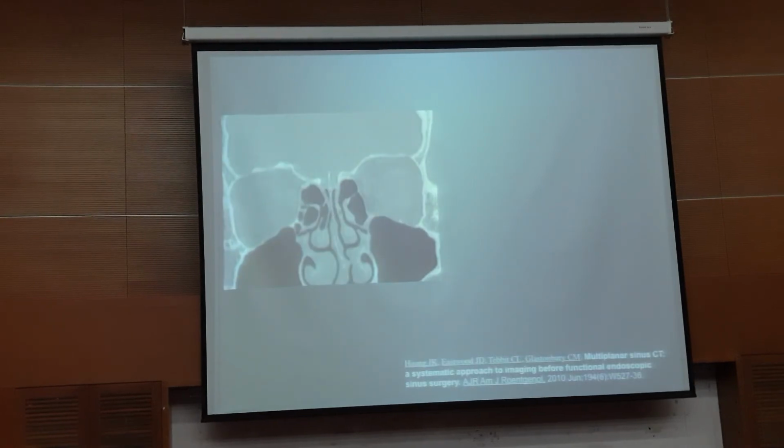Okay, this one. Alright, so this one, okay, if you guys know what the anterior ethmoidal artery is, anterior ethmoidal canal, you know what that is, right? Okay, good. I think breakfast should be coming up soon. You can see everybody nodding off already. I will be ending very soon, so just a couple more slides.